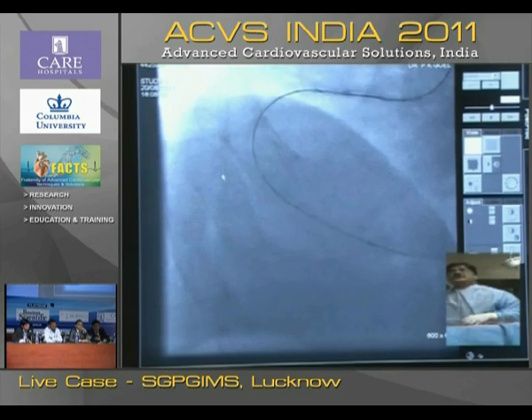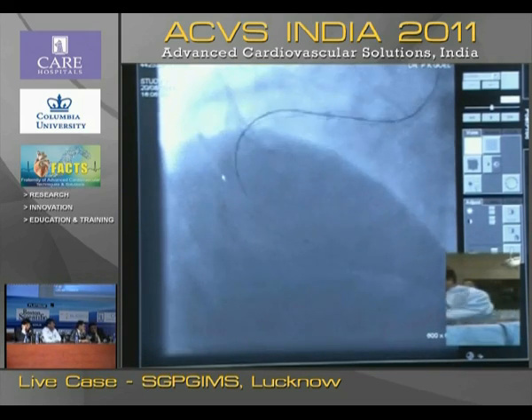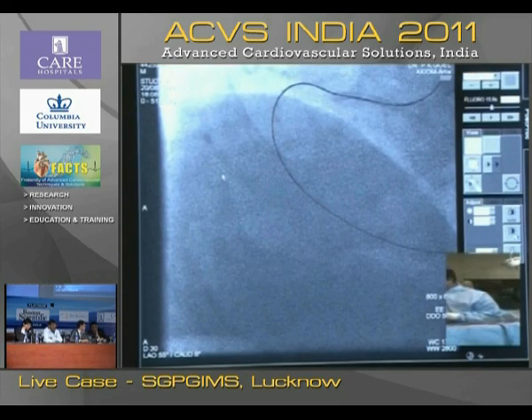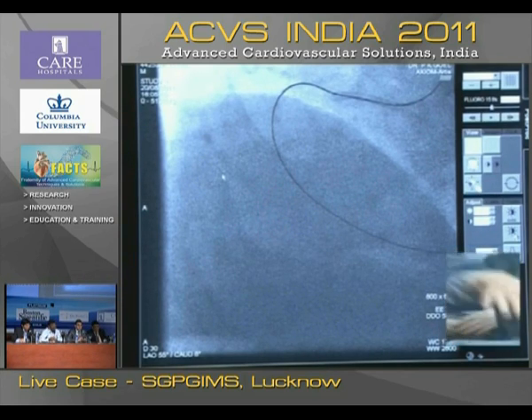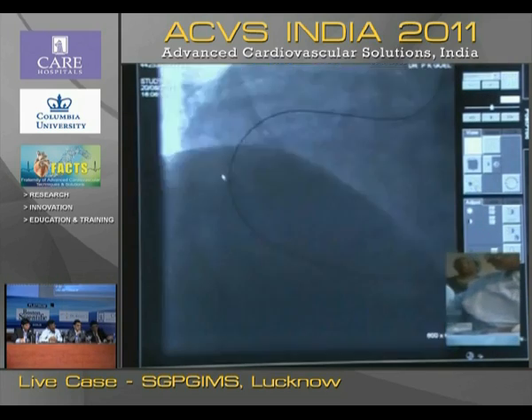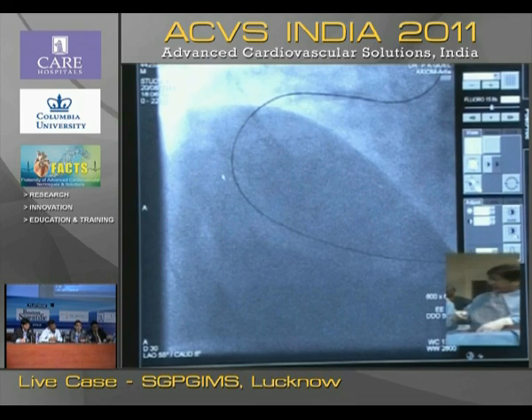I think I'll use a micro. Give me a microcatheter, please. Extension though. I think I'll use a microcatheter. People routinely do. See? That is safer. Okay, all right. Please thread. Don't dent it. Has it come out? Thread it in. Hold it.